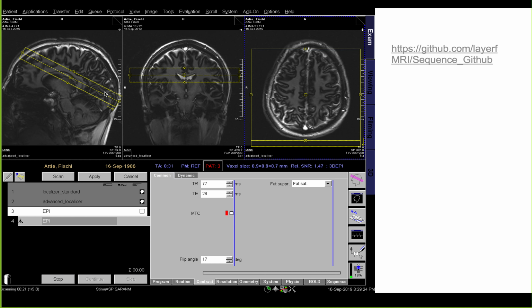Without knowing where this sulcus is, with the kind of previous standard localizer, you usually have troubles. If you're more interested in the motor cortex, then you also nicely see the omega shapes to adjust the slices accordingly. As you probably know already, the yellow box in the Siemens environment tells you where you acquire your images. So this is, I think, a slab of 26 slices, and everything within the yellow box is acquired. Everything outside the yellow box is ignored and not captured.